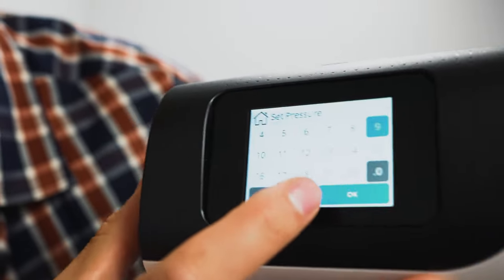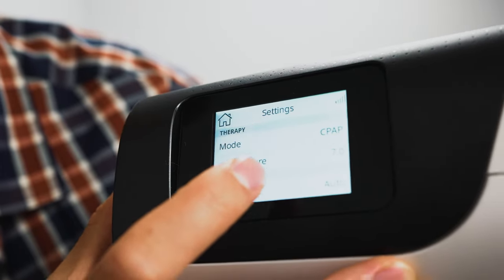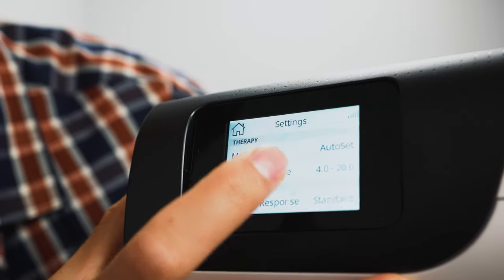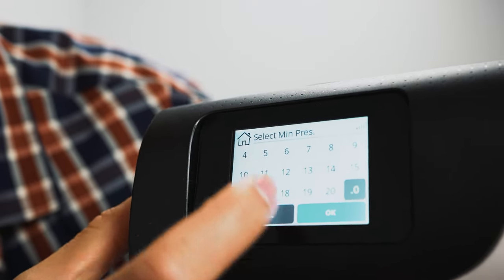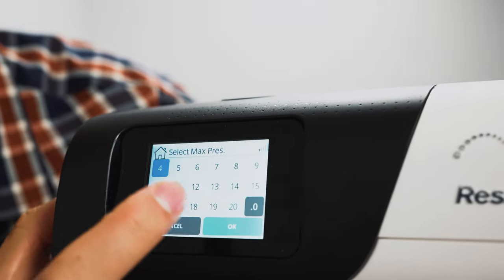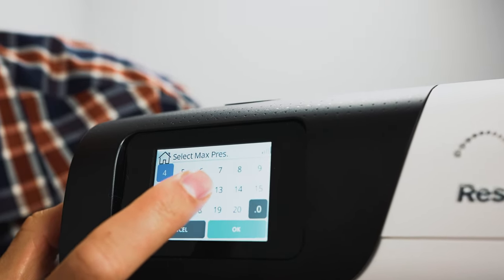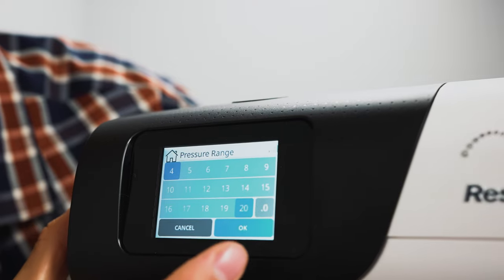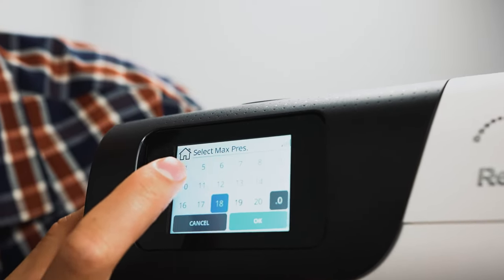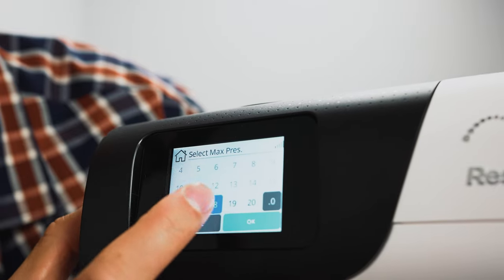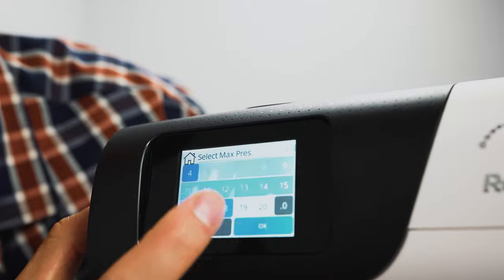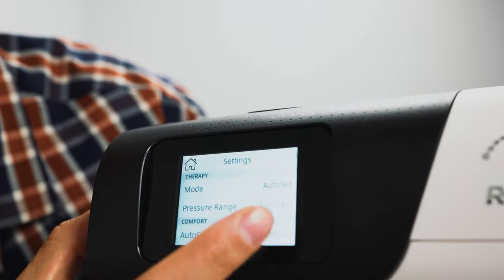So that's how you change it on this device here. And then if you have auto, let's click auto, then we got a pressure range. So select min pressure. Let's say we have a four. And then our max pressure, we have 20. So say that's what you're working with, maybe bump this down to an 18. So just like that. So now it's four to 18.